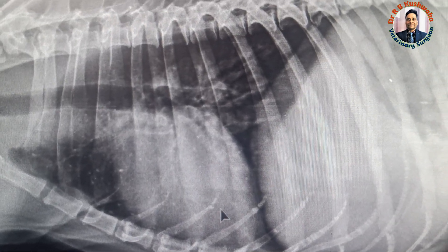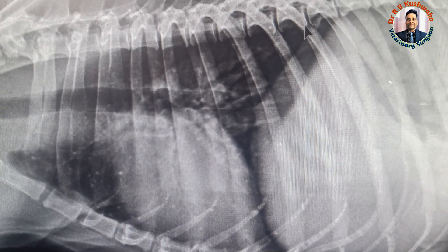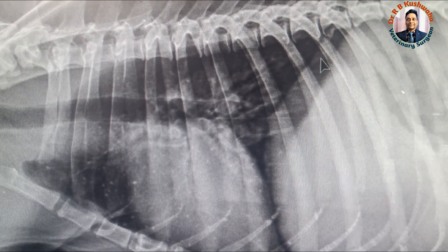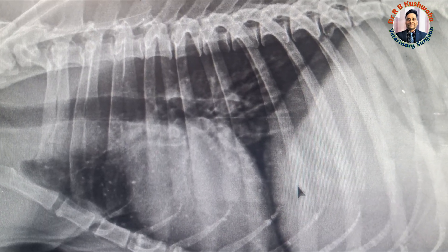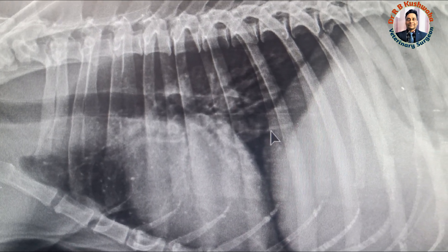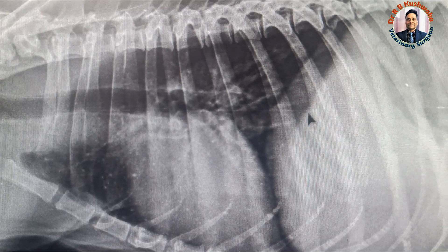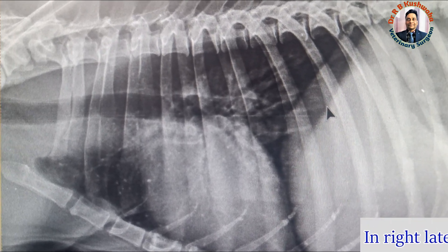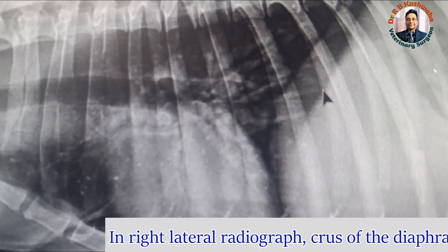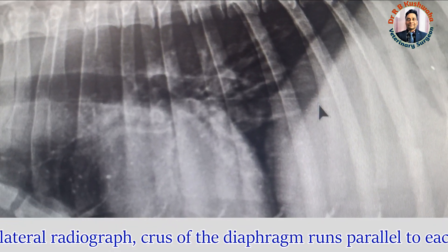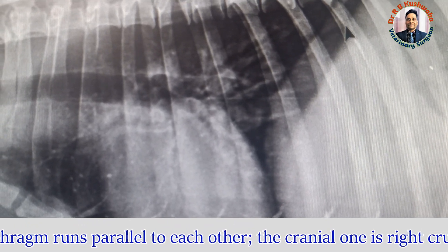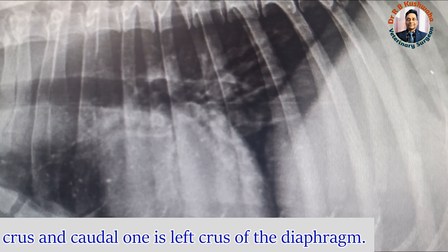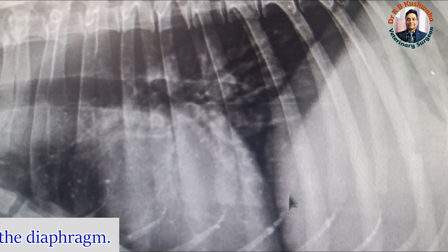Now look at this particular radiograph. This radiograph has also been taken in lateral recumbency. But if you see, the crura of the diaphragm — this is one crus and this is the other — they are not crossing each other at the caudal vena cava level. The caudal crus runs parallel to the cranial one. If the crura of the diaphragm run parallel, that means this particular radiograph was taken in right lateral recumbency. So the cranial crus is the right crus of the diaphragm and the caudal one is the left crus.